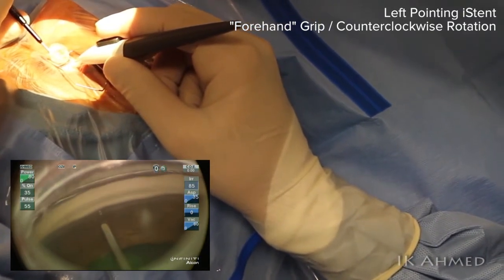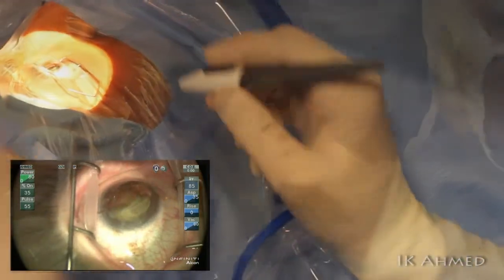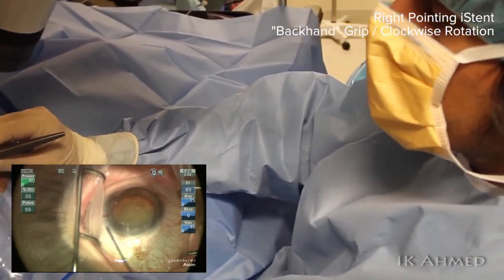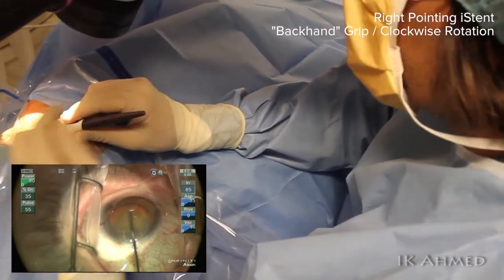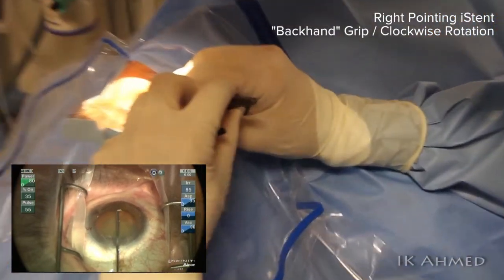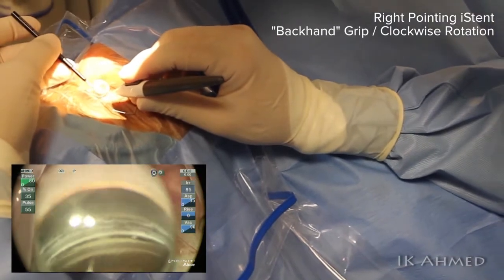We are holding the device applicator in a forehand grip and pass the device in a counterclockwise fashion. Opposed to the forehand grip, this is the backhand grip — notice our elbow goes up a little bit. We have an overhand grip, more like holding a cigar or a cigarette as opposed to holding a pen. This overhand or backhand grip allows us to flex our wrist to pass the device and follow about a 30 to 40 degree arc to allow the straight device to follow the curved angle.